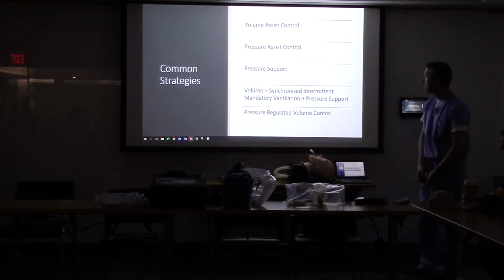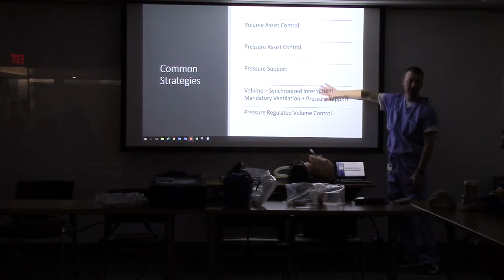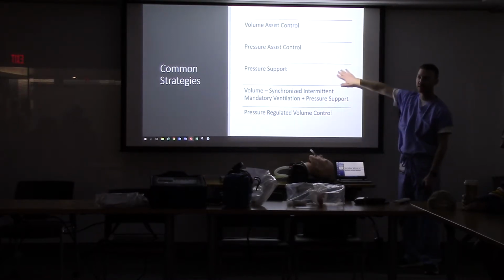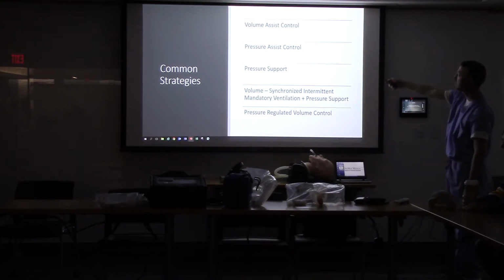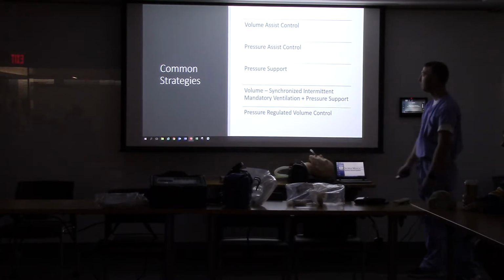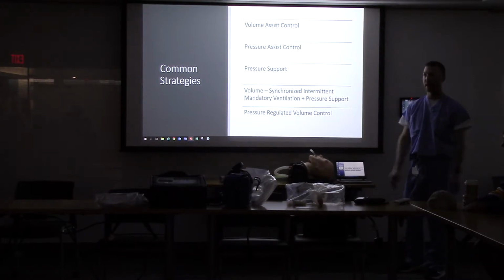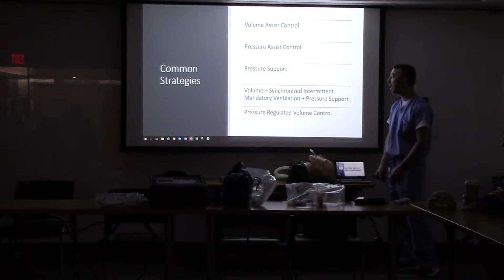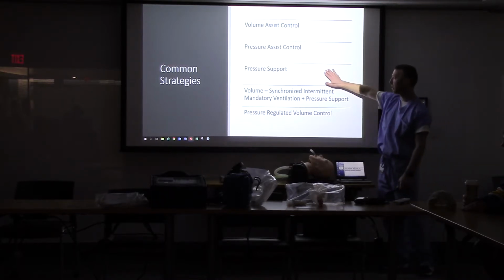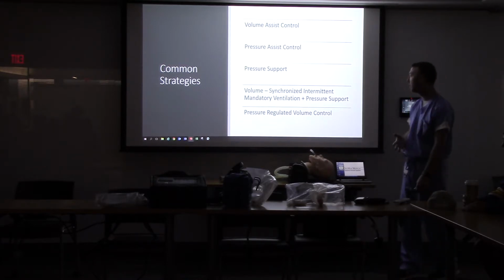So now, do you recognize hearing these in the hospital on transfers and stuff like that? Does this start to seem like a patient you may have transferred in the recent past? Most patients, like I said before, will be on volume mode assist control. And then, let's say you got a patient who's trached but awake and just living at a facility. If they are awake and doing some of the work, they'll be on pressure support, which is just like a CPAP or a BiPAP or something like that.